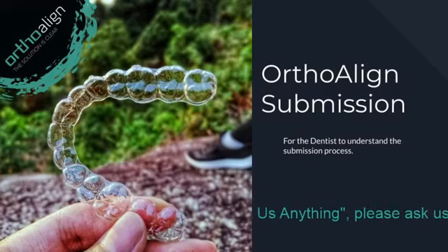For all these, the upper and lower occlusals, right bite and left bite, you can use oral mirrors to take the pictures much more easily. These pictures are definitely very important, and our orthodontist can also use them to assess possible orthodontic treatment for the patient.